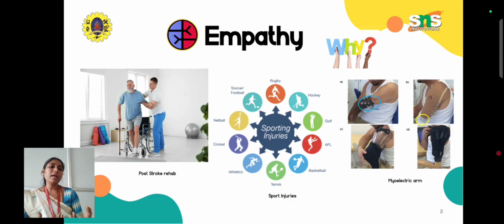For that, again, they need the help of an EMG device, which gives you the activity of specific muscles with their stretching capacity or strengthening capacity, and it also gives a detailed visualization of the fatigue characteristics of a specific muscle. From this, the athletes, the trainers or a physiotherapist can assist them in deciding which exercise to do, or to what extent to go for intense training. In this way the EMG again helps.